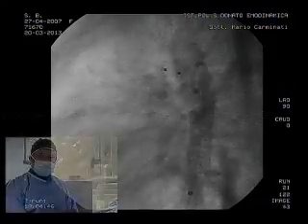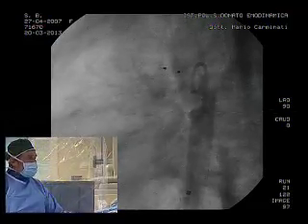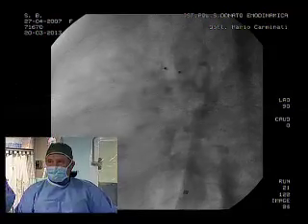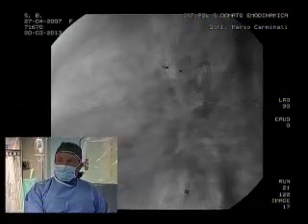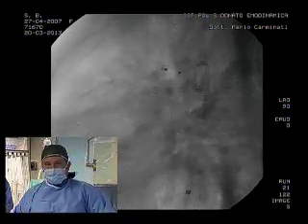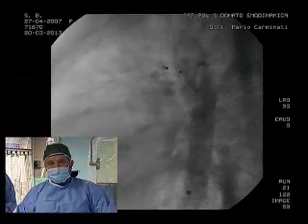Are you happy with that? We are very happy with this. I think it's the best you can do. If you would have used a larger device, I think you would have more problems in the middle of the aorta. I think that's the right compromise, as you said. Yeah, that's right. Congratulations. Very good job. Yeah, thank you very much.